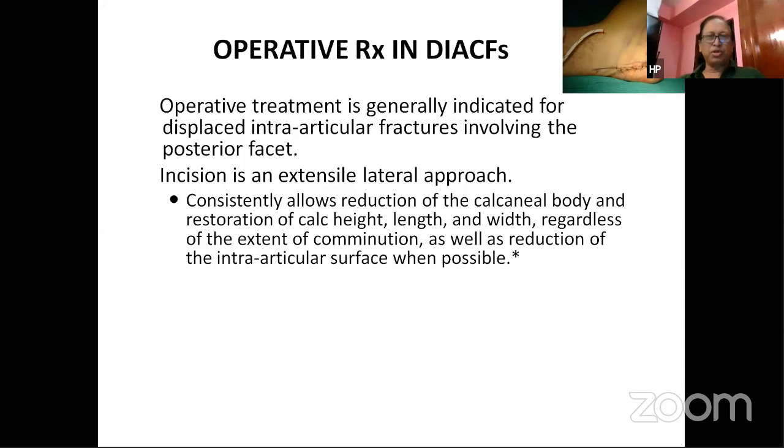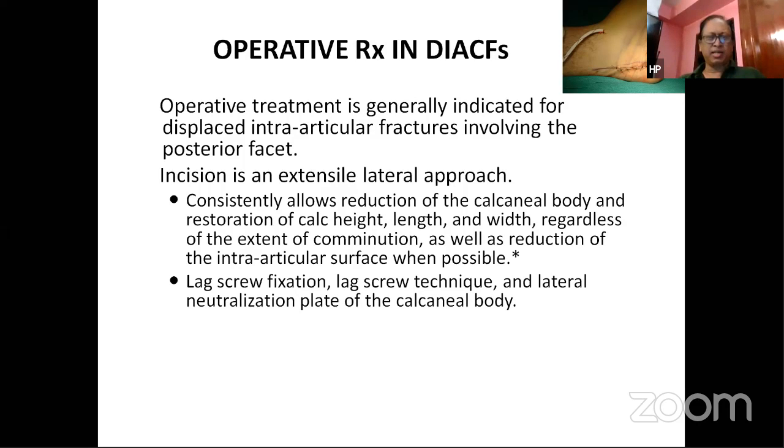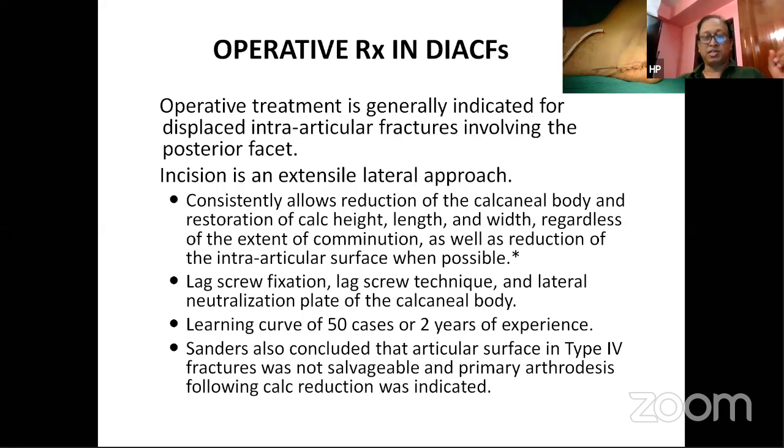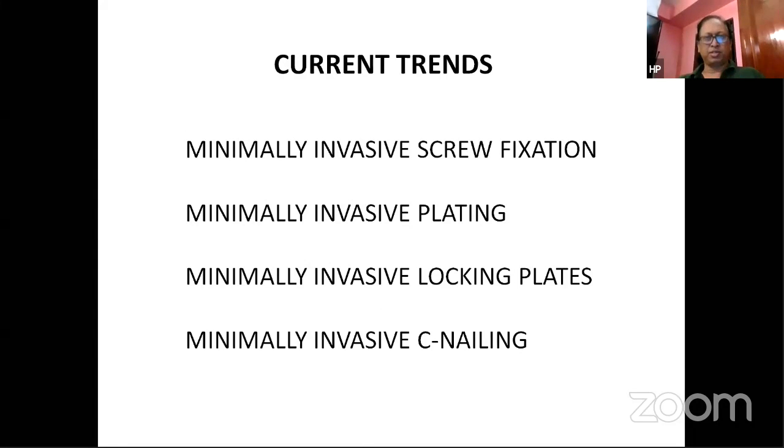Here it is important to realize that the operative treatment in displaced intra-articular fractures is to allow reduction of the calcaneal body and restore the height, length, and width. Everybody has mentioned that. Lag screw fixation, lag screw technique, lateral neutralization plate of the body, everybody has shown. But the learning curve is very important in MIS. One needs to do at least 50 cases or 2 years of experience in open reduction and internal fixation before we can start thinking about doing MIS surgery in these types of fractures.